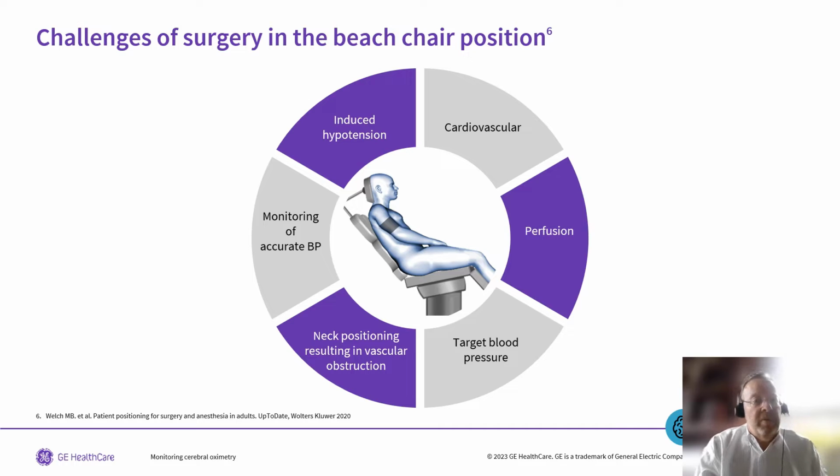So if you put together some of the risks of the patient population and the effects of positioning, you get a sense of some of the challenges of surgery in the beach chair position. These challenges are typically additive, so multiple factors must be considered for each patient.